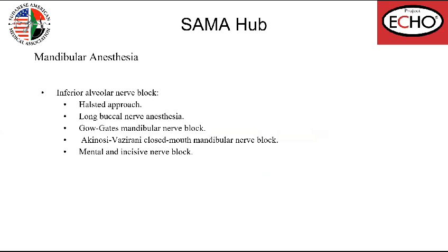Okay, mandibular anesthesia, inferior alveolar nerve block, can be gained through a variety of methods: Halsted approach, long buccal nerve anesthesia.